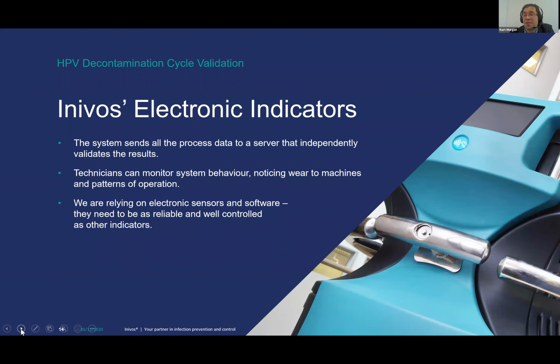The other point is that trials are normally conducted to show that cycles are successful. We need to acknowledge that it is complicated and that conditions vary, and we need to investigate the mechanism for success and for failure to understand the full range of success and failure criteria and thresholds. The electronic indicator is a collection of sensor results and reading thresholds. They both have to be right for the indicator to be effective. So back to Tautvydas, hopefully.